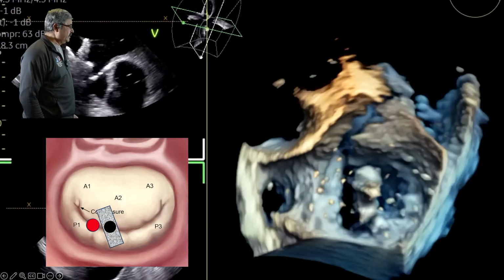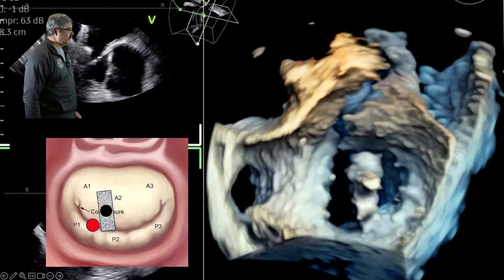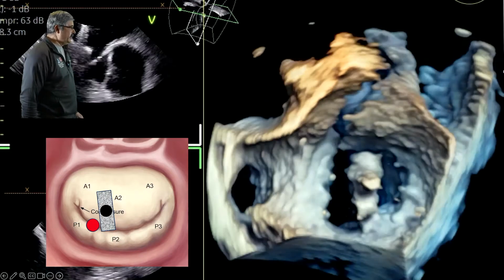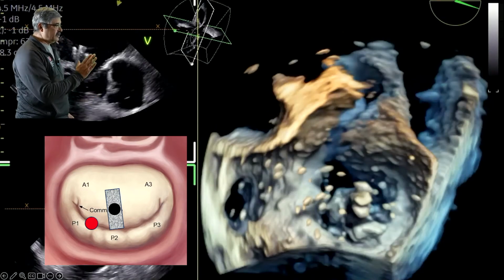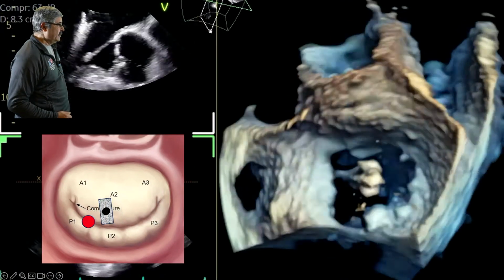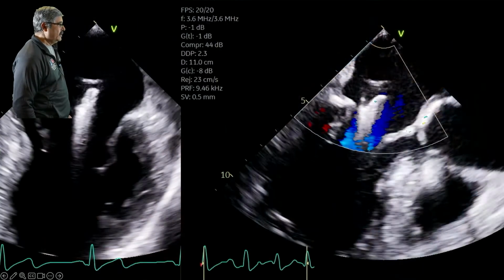They have moved a little bit now, straightened it completely orthogonal to the line of coaptation, but still not over the clip. Now you can see it better that they're moving the clip a little bit more medially. They have closed the clip, going to about cross and become apneic, but you see as the patient became apneic, it has drifted a little bit more medially. Now we are trying to correct it and move it more laterally over A1P1.